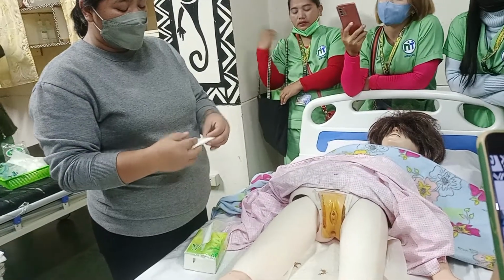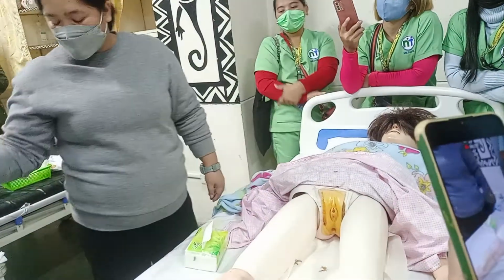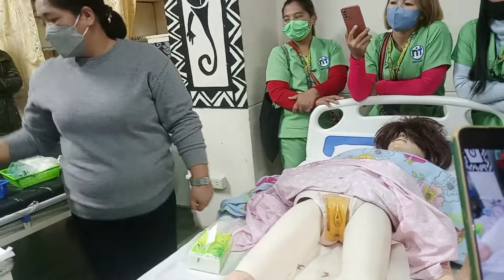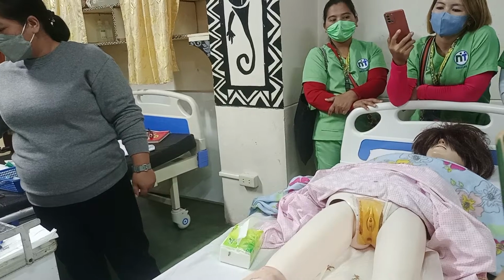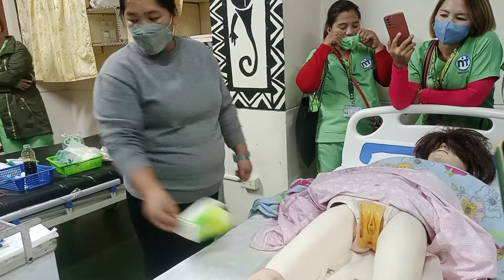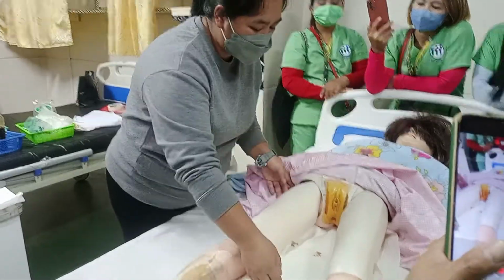And then, observe for dignity's sake ng ating pasyente, then you can wipe. So, hindi ka naman na naka-gloves, then you just, okay, discard another one as necessary. Okay? So, gawin niyo yung mga technique para hindi nyo matatouch yung patient kahit na kayo ay hindi naka-gloves. Okay? So, there you go. Thank you, ma'am, for that cooperation.